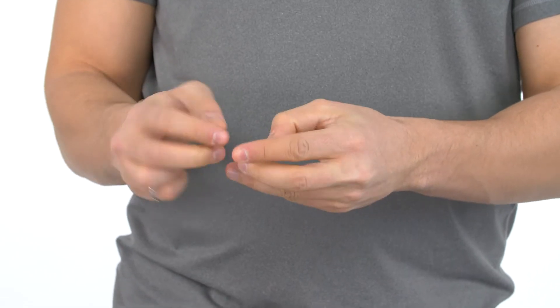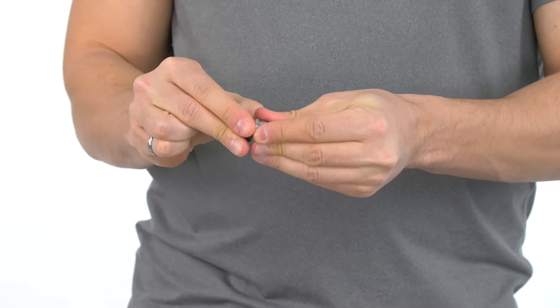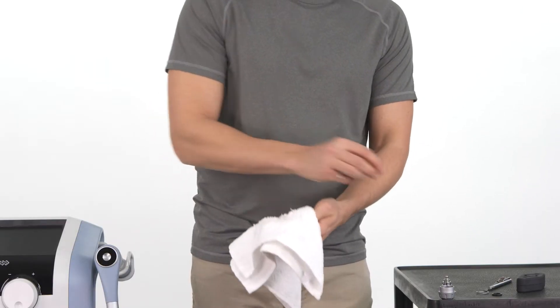Remove the washers from the transmitter. Thoroughly clean the washers and the transmitter.